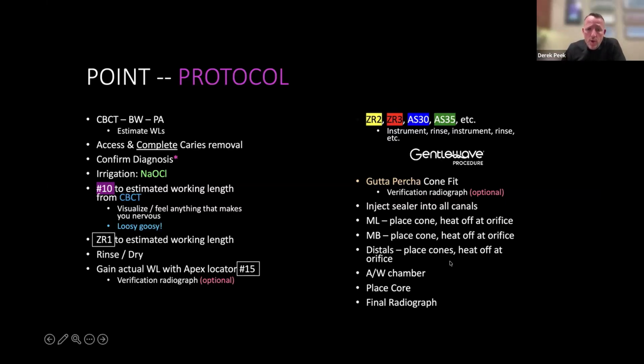If you do a core, you do a core, you do your final radiograph, and that's it. So it's pretty much access, do a little bit of instrumenting, run the GentleWave, fill it up. I pretty much tell people I just got to find them, clean them, and fill them. That's really the 3 things that we have to do.